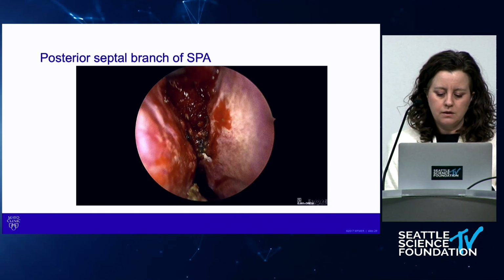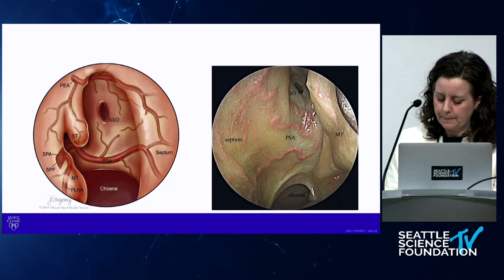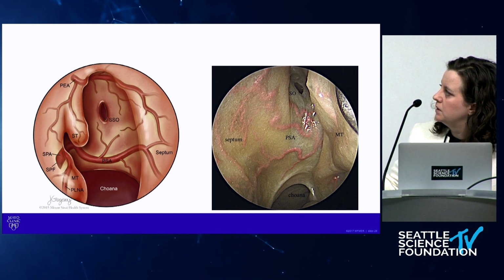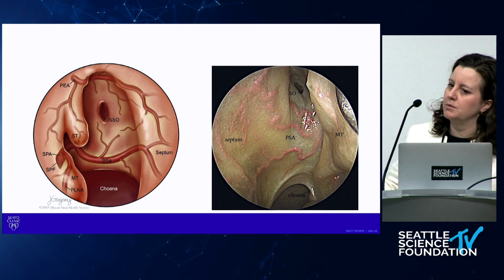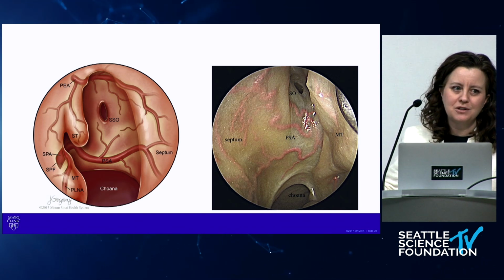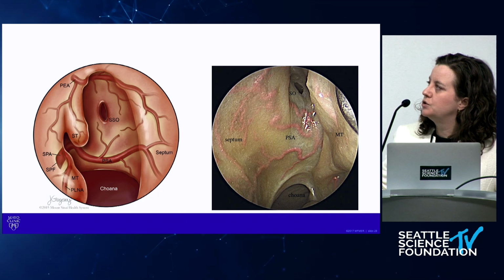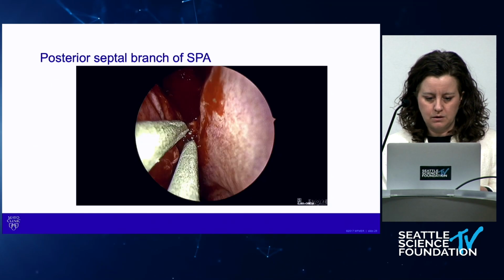The other thing I was going to say about the sphenoid, let me go back one. Your sphenoid os, let's look on this side here. This is the medial side of that sphenoid os. I tell the residents, again, to use from a different specialty, I say this is like the anterior commissure of your sphenoid. I don't like to take that medial wall off. I want to save some normal, natural mucosa and not scar it. So I'm going to extend superiorly and laterally to make that sphenoidotomy and ideally leave that medial side alone.